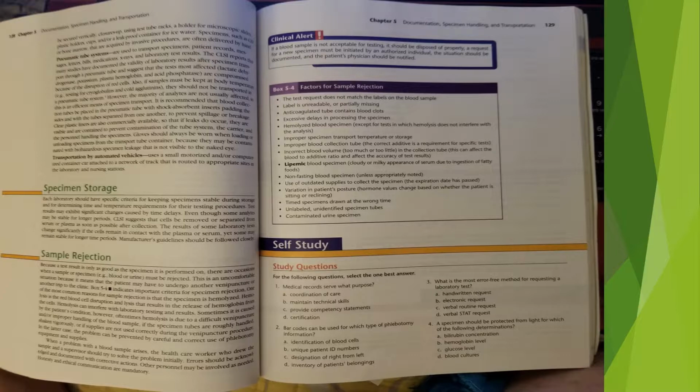Box 5.4, factors for sample rejection. The test request does not match the labels on the blood sample. The label is unreadable or partially missing. Anticoagulated tube contains blood clots. Excessive delays in processing the specimen. Hemolyzed blood specimen, except for tests in which hemolysis does not interfere with analysis. Improper specimen transportation, temperature, or storage.